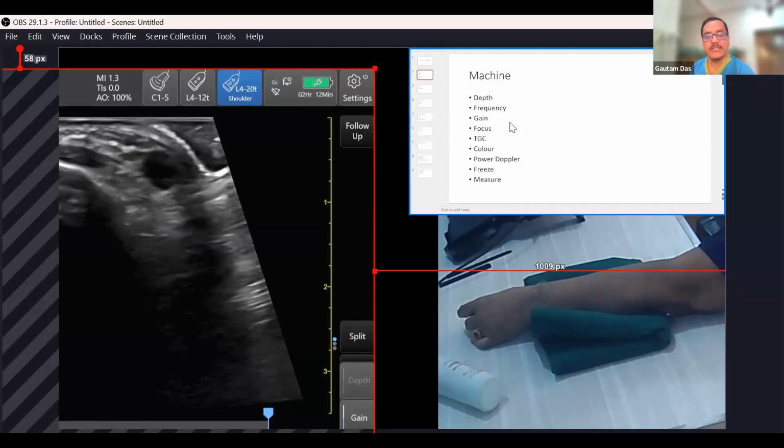And again, it depends on the person, how an examiner likes to look at it, whether he likes brighter structures or less bright structures. But normally we should adjust it somewhere around the mid-range that gives the best visibility of the structures.